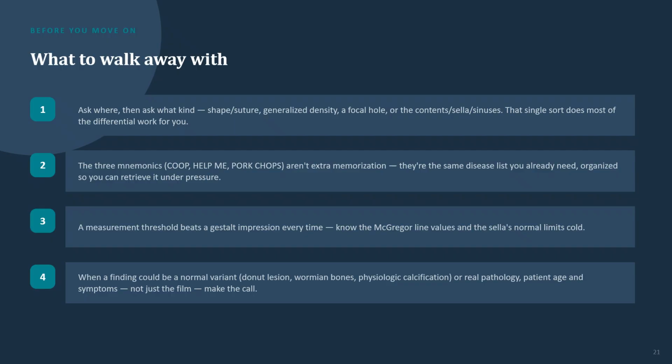Here's our final takeaway from our skull chapter, our skull patterns chapter. So again, our goal is not to memorize all of these diseases, and our goal is definitely not to diagnose as a technologist, but we do want to have an idea of what normal looks like and also what abnormal can look like. So instead, when we're looking at some of our images, especially with the skull, since we're focused on that, we're looking for things such as, is the bone darker or whiter than it normally would be?